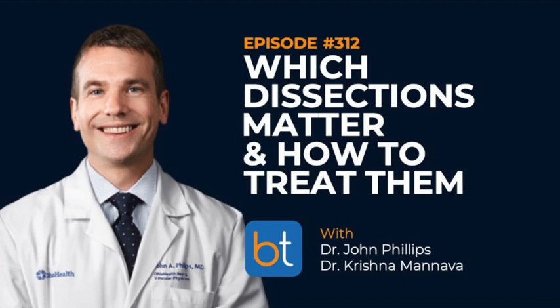I do these things called Tack Chats. I started them with Philips, well, it was within Tack Vascular, just before the pandemic, because frankly, what's new in peripheral arterial disease? Really not much. Obviously we've got drug-coated stuff, and maybe we'll get some new limus devices in the future, but the tacks are something new. And again, not every dissection needs to be treated, but I think this has started a conversation about dissections and how to assess them and how to figure out, is it flow limiting or not?